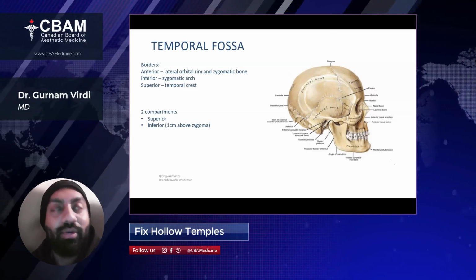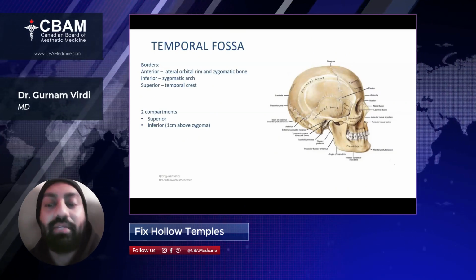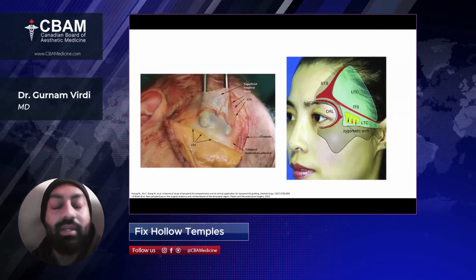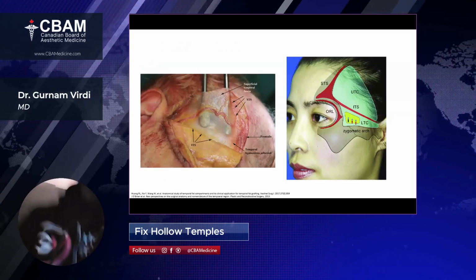As I mentioned on the forehead, 2 things. Indication, here is a hollowing. How do you safely do it? Needle or cannula, which I'll talk to you about after I've shown you a few slides here.